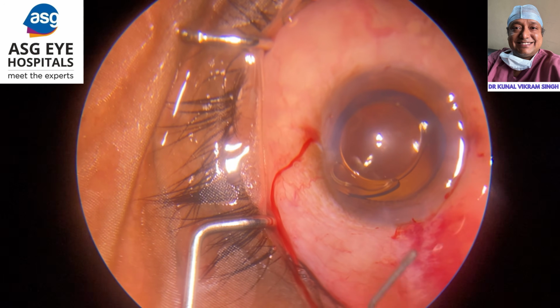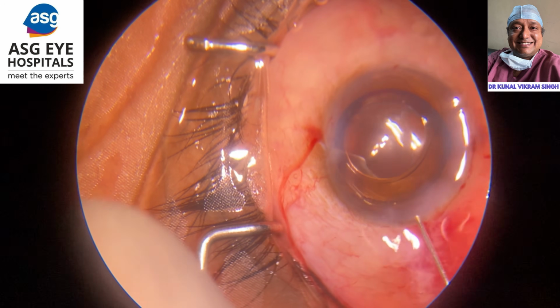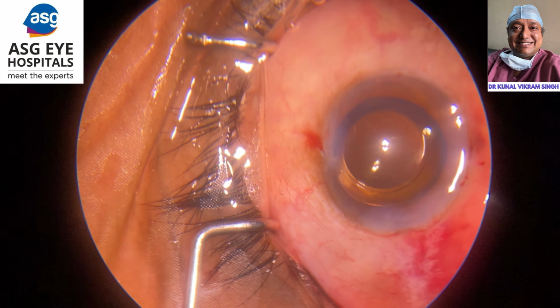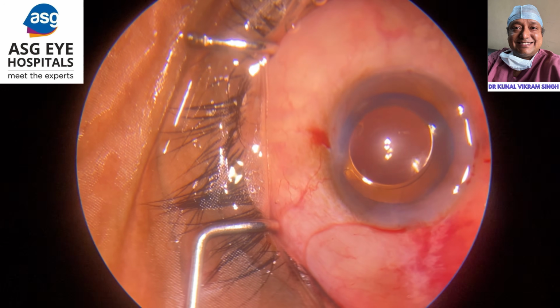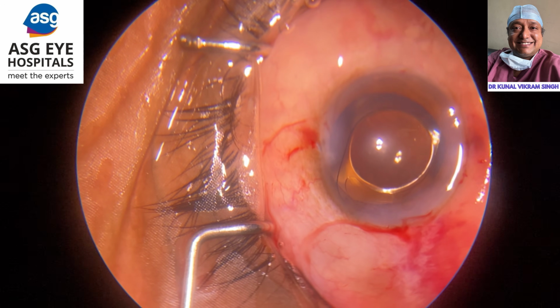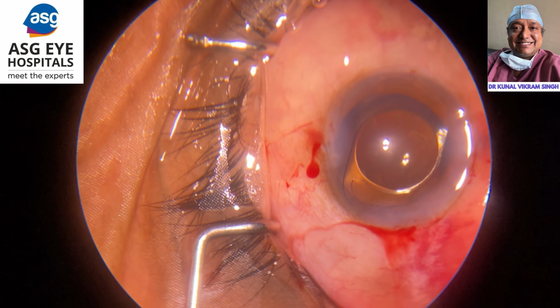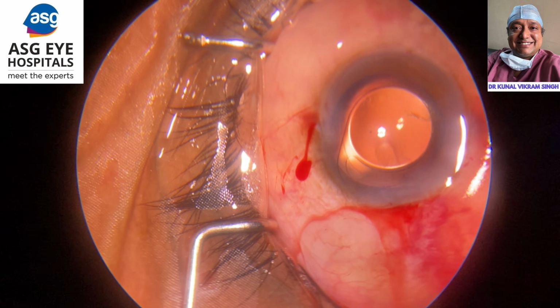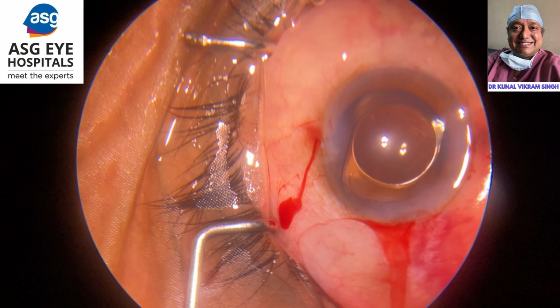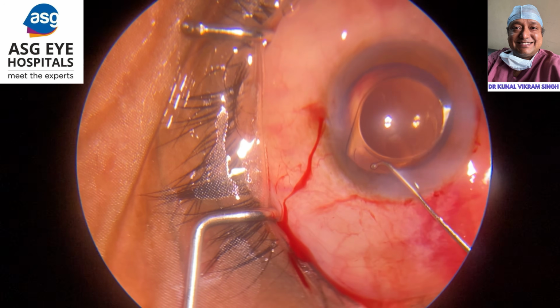But what happened was that the AC was flat at this time. The IOP had also risen, and the eyeball was tight. Generally in this scenario, when the pressure of the eye really increases, patients start squeezing their eye. The iris starts to pop out from the corneal incisions, and that leads to a cascade of events, and generally all the problems that we have in aqueous misdirection.